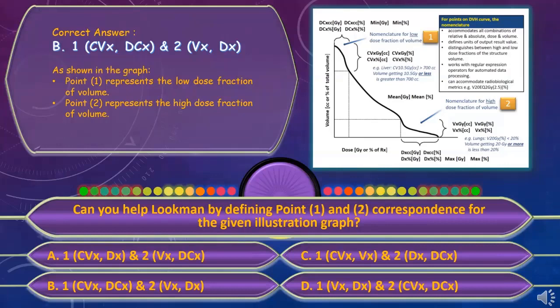So what we did in our department, we said, okay, we sit with the physicians. Let's say for the breast cases, what type of structures would you like to be there? They discuss among each other, and we agreed on a certain template of structure set. Then we created this in our system. And then we went for the prostate, for the rectum, for the, let's say, pelvic region, and so on.